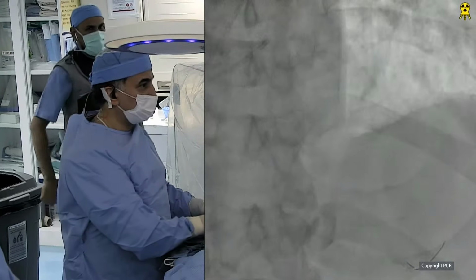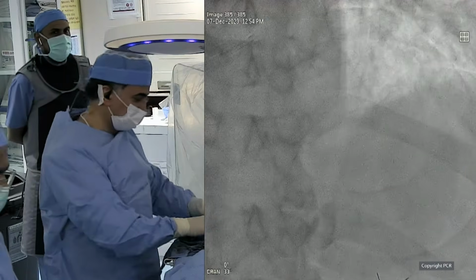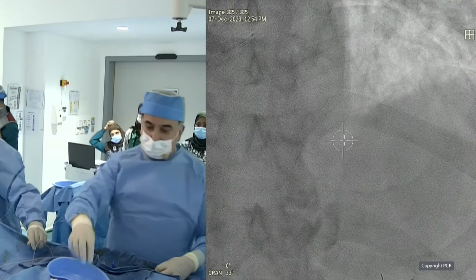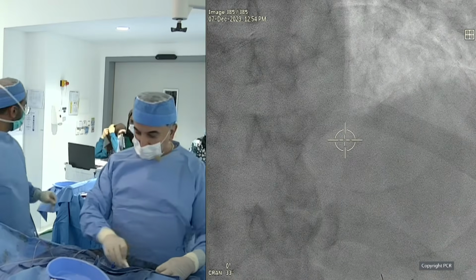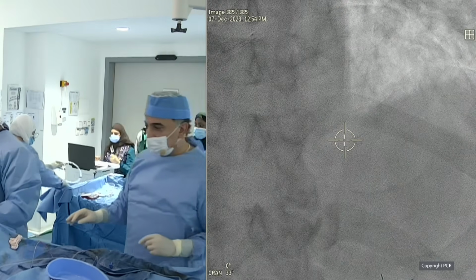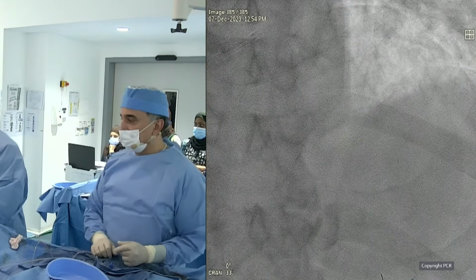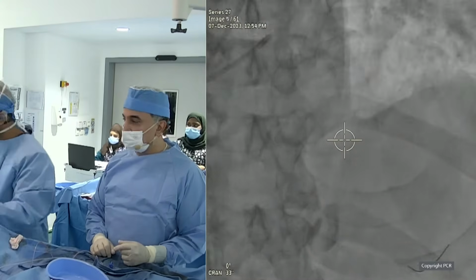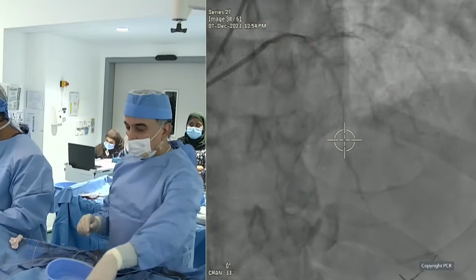With such diffuse disease in both, I believe the safest way is to do a two-stent strategy up front because it's the only diagonal, as Giulio said, supplying the whole lateral and part of the anterior wall. So my strategy would be to debulk, do OCT, do NC balloon predilatation, and then focus on the bifurcation.